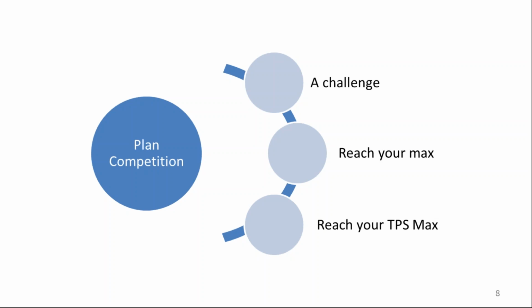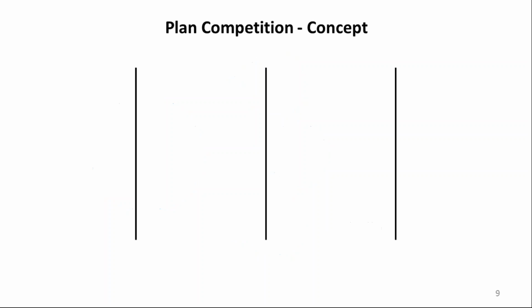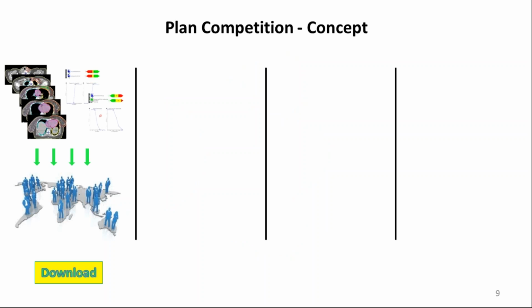This is why we would like to share the best practice worldwide, so that you may learn something from different planners who are using the same treatment planning system that you use. This is how you will improve, and the quality of plans generated by your clinic will surely improve.